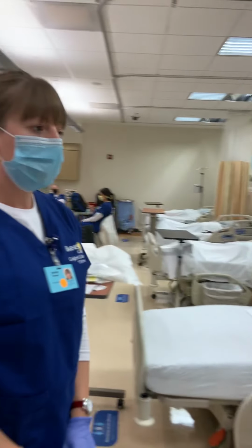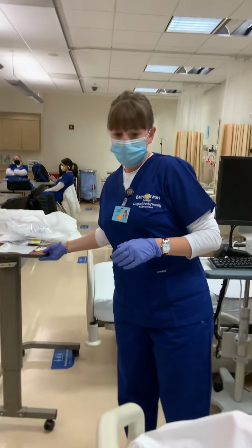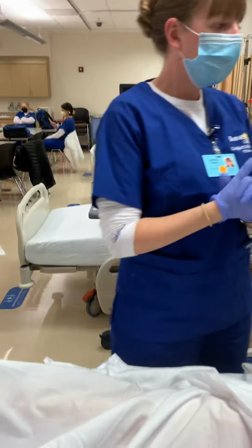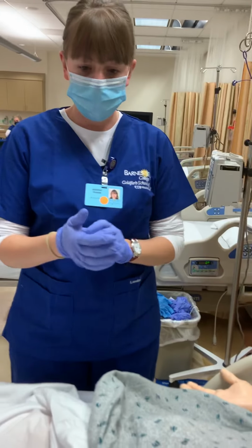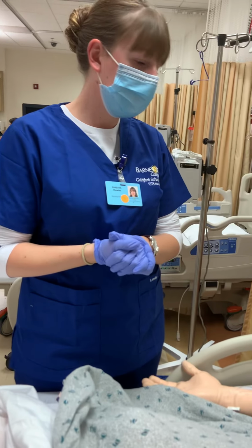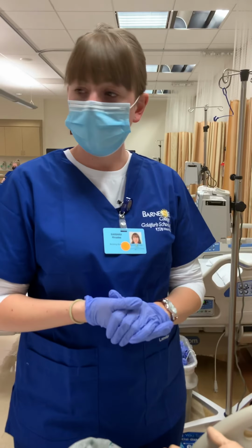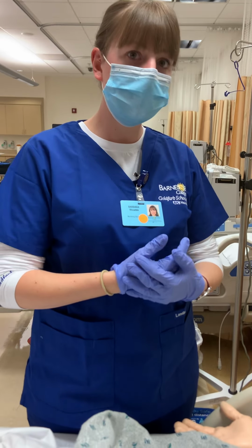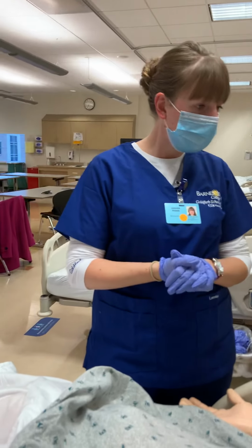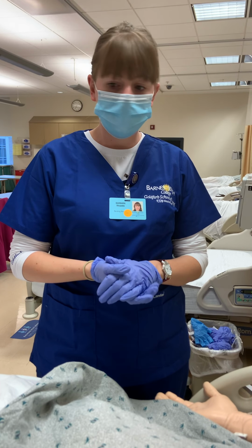So I'll be coming back to the patient's room, knock on the door. All right, ma'am, I'm back here today to remove the catheter. Can you please confirm your name and date of birth for me? Yes, my name is Finn Utley and my date of birth is 12/24/1987. Okay, great. And ma'am, do you have any known allergies? Yes, latex. Okay, great. All right, so today I'm going to be removing the catheter that we inserted before. So we'll get going on that.